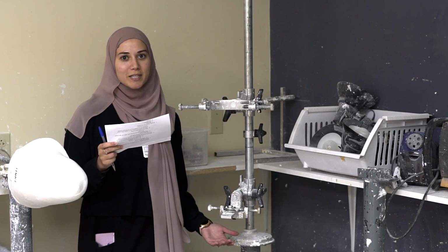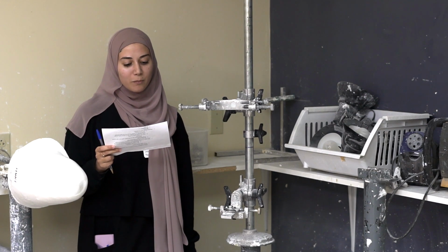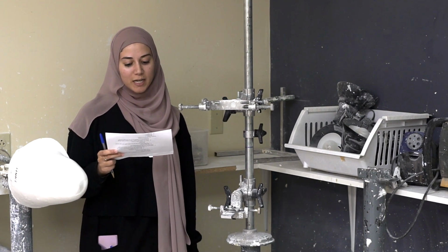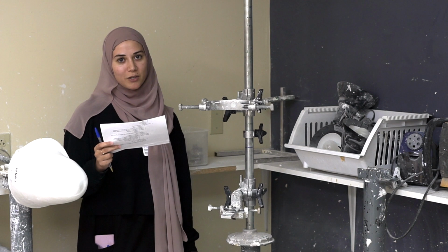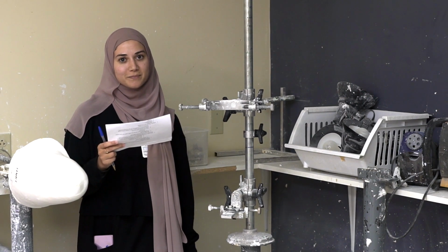Also known as the vertical alignment jig, it is primarily used for aligning prosthetic devices. More importantly, it allows you to transfer alignment from a check socket to a finished final socket. And now we are going to talk about each component and how to use them.